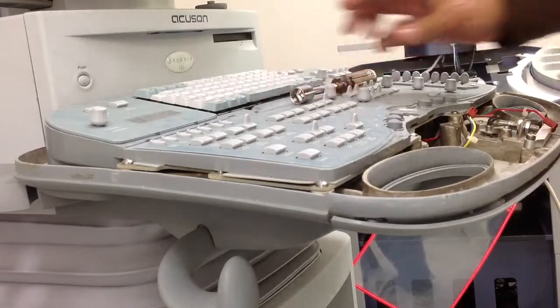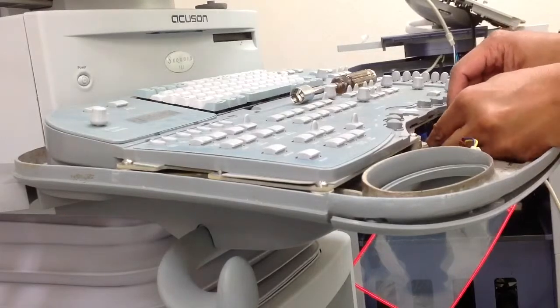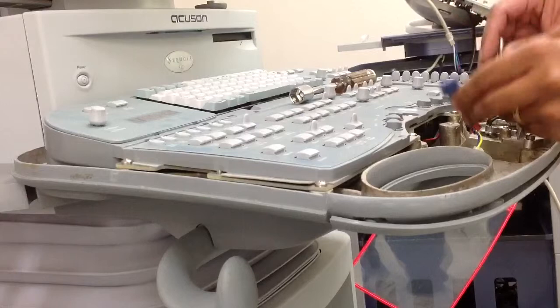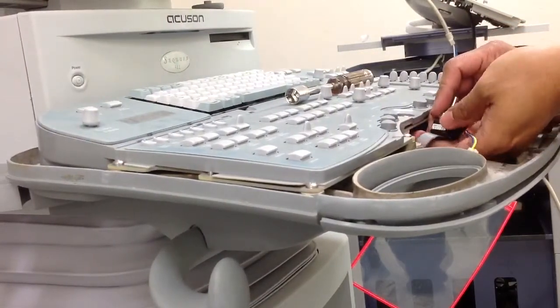Putting it back, it's the same thing, doing it the opposite way. First, connect the cable. Make sure it's properly connected.